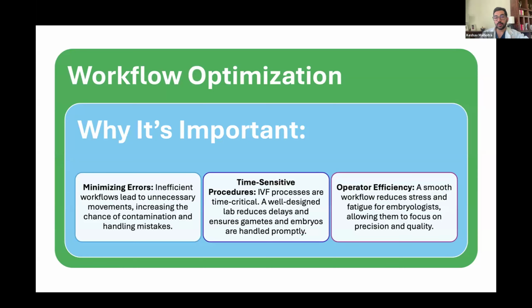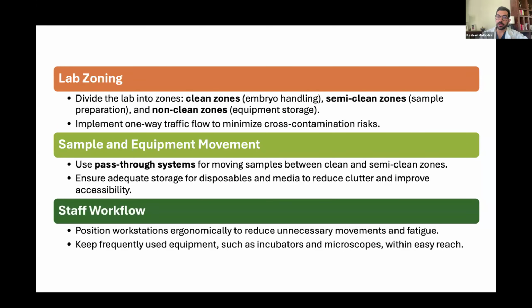Whenever a lab is designed, you need to look at workflow optimization. And this is important because we want to minimize risks. We want to time the procedures and not take too long between traveling from one workstation to, let's say, the embryo transfer bed, or from a workstation to the incubator. So we really need to plan accordingly. And then we also want to increase the efficiency of the operator, because if the embryologist is just walking from one room to the other room all day, obviously they're going to get stressed and they're going to get fatigued, and in the long run this might be one of the causes for a burnout.